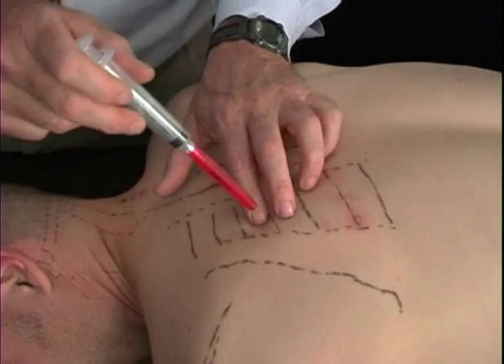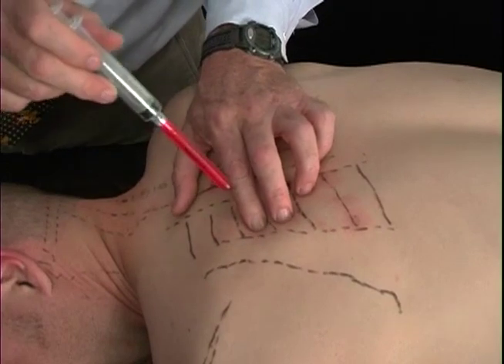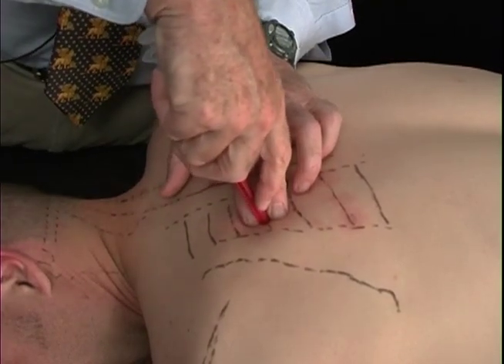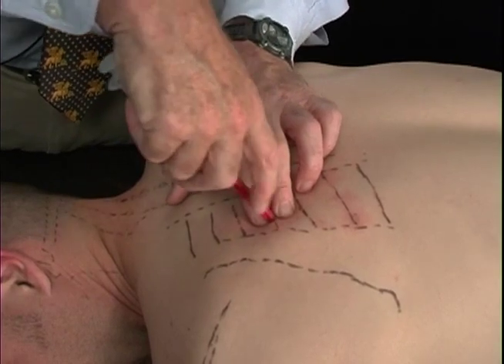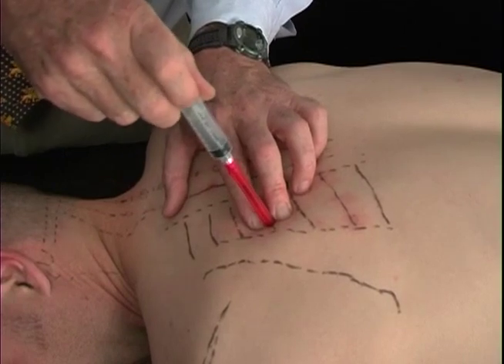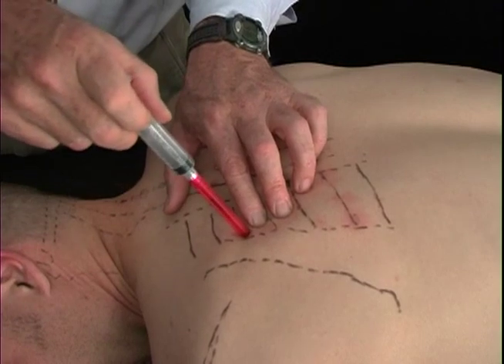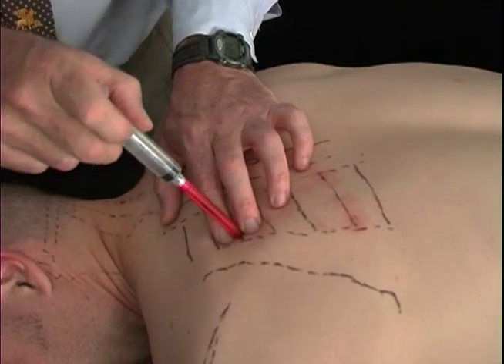When we do this rib that we can feel the depth on and feel the rib with a skin compression down, going back in, we watch how deeply the needle goes. You get used to doing this, just kind of mentally marking how deep that is. And so once you've found that point, how deep the needle is, you don't want to exceed that depth with your next injection up here. Again, a lot of skin compression coming down to that depth.